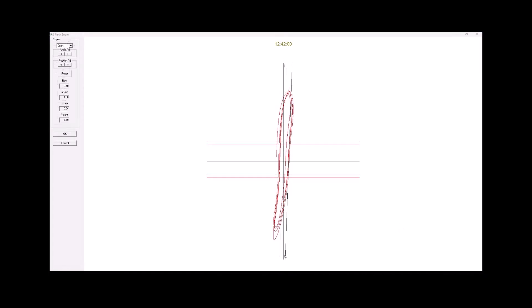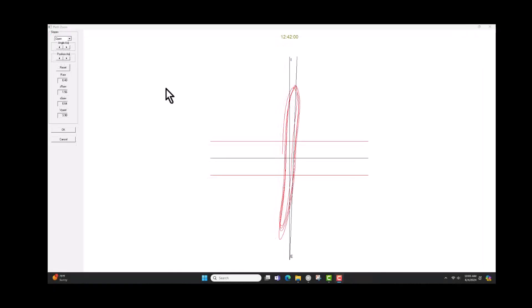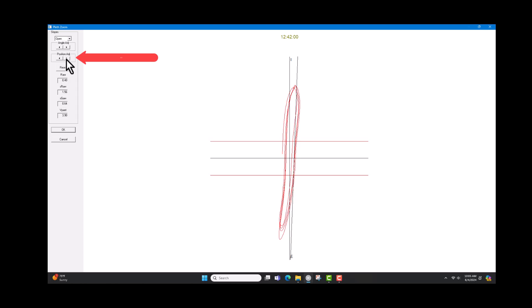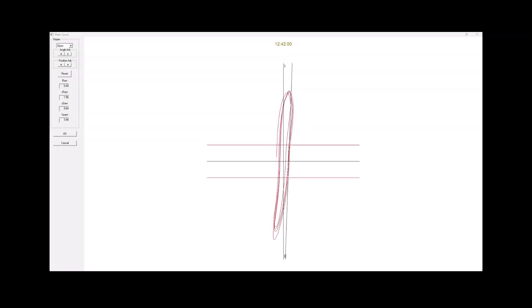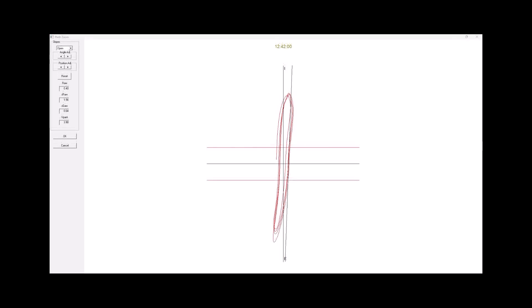Consistency from patient to patient and visit to visit. It is also recommended to move the line of best fit to the right side of the open shutter tracing. The position adjust arrows in the upper left can be used to move the line to the right or to bring it out if hidden within the red trace. Using the right side of the graph and only the data between the red flow rate lines, ensure that the line of best fit is at the same angle as the red tracing. Moving the line left or right does not change any of the values — only adjusting the angle changes the airway resistance value. After a change has been made, select the OK button.